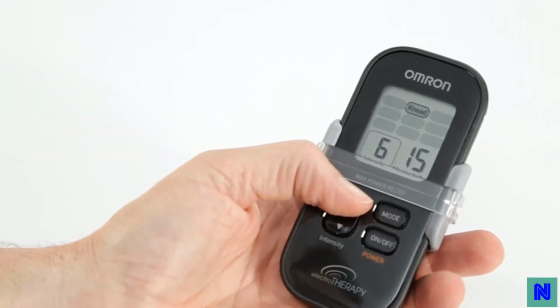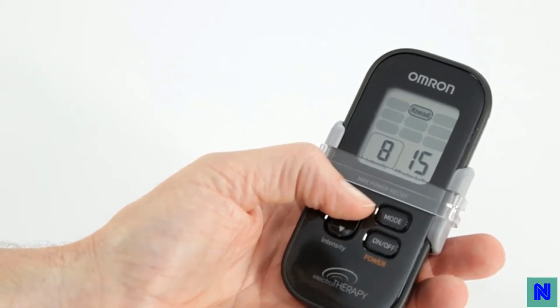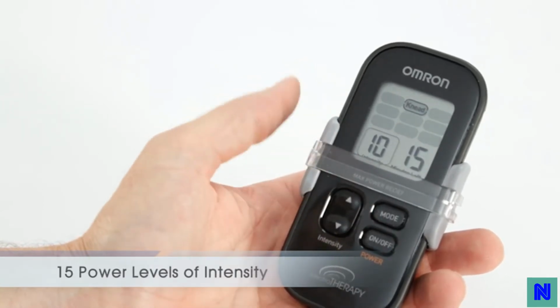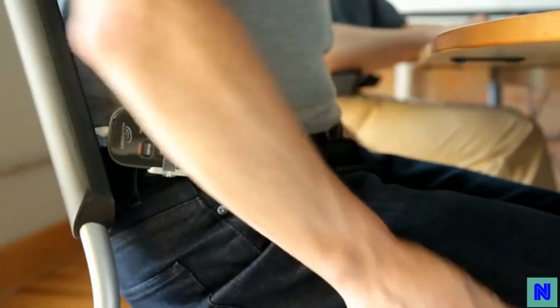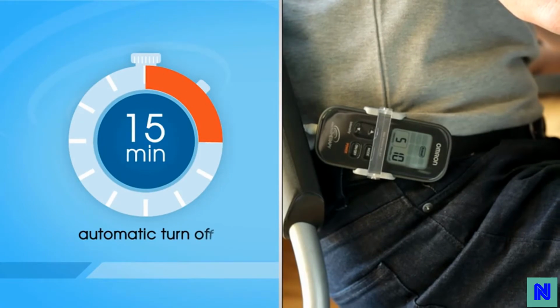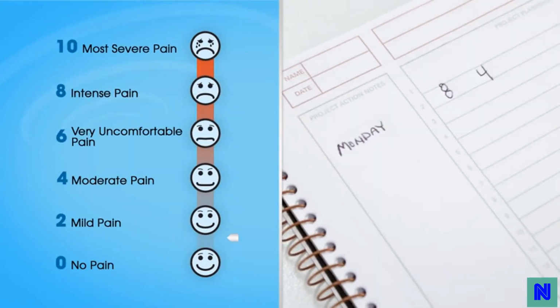Once you find the right mode, you can easily adjust the intensity level by pushing up the button for more or down for less power. There are 15 power levels of intensity. Put the unit on your belt and go about your activities. The unit will turn off within 15 minutes of turning it on. When the session has stopped, rate your pain again.